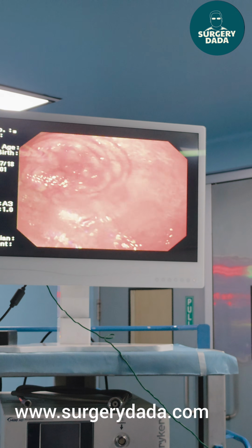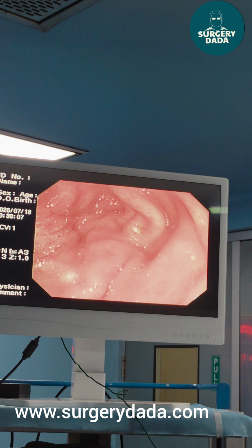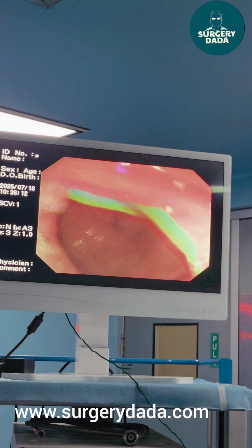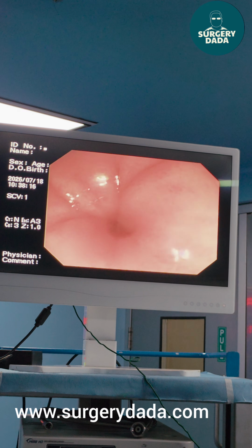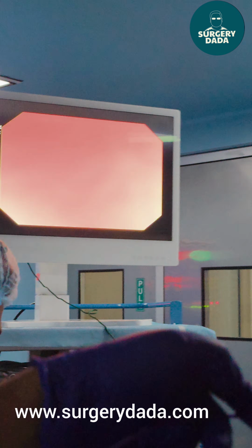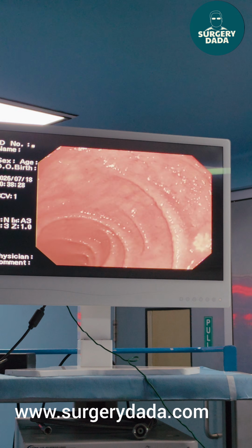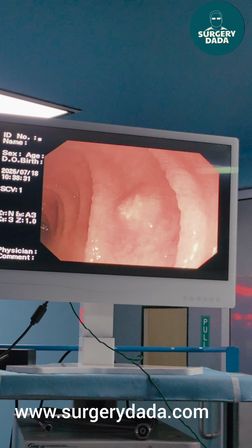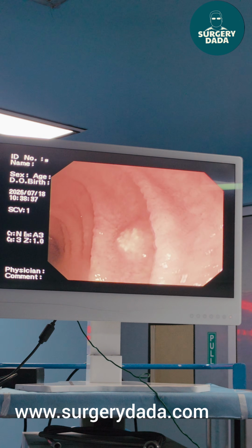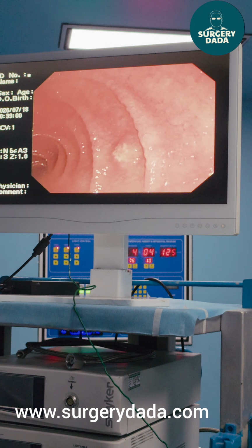You can see this is the pylorus that you have. Let us see what is in store for us in the duodenum also. So we are into the duodenum of this patient. There is some duodenitis. Can you see an ulcer? You need to take a biopsy of this. Yeah. So we'll take the biopsy of this.